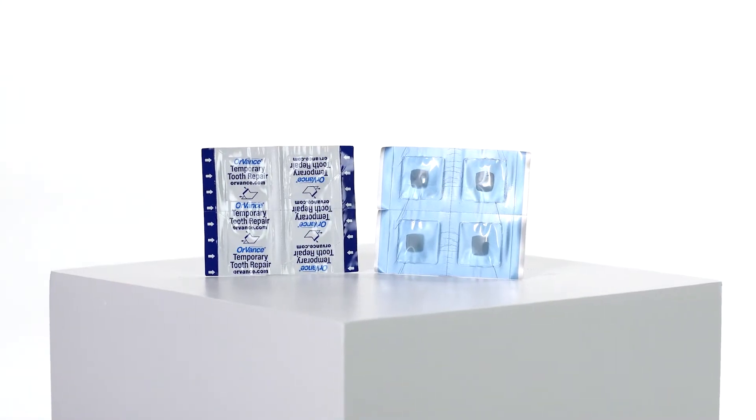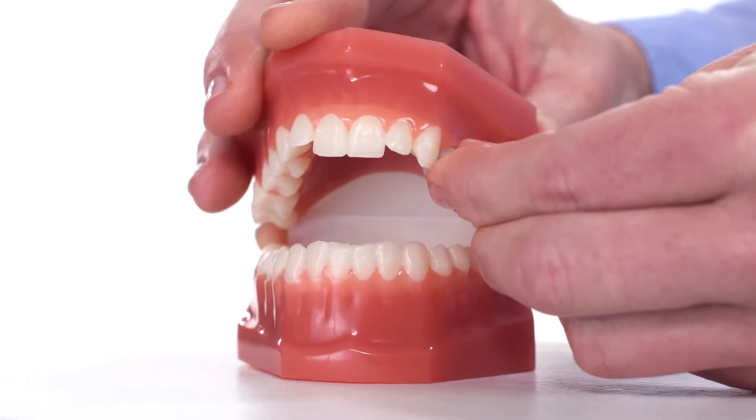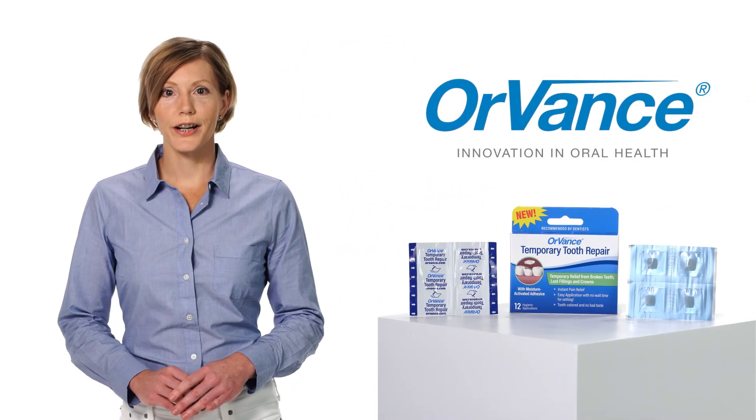Orvance Temporary Tooth Repair is not a cement, so there's no wait time for setting — just a 10-second application time with fast and easy removal before proper dental treatment.